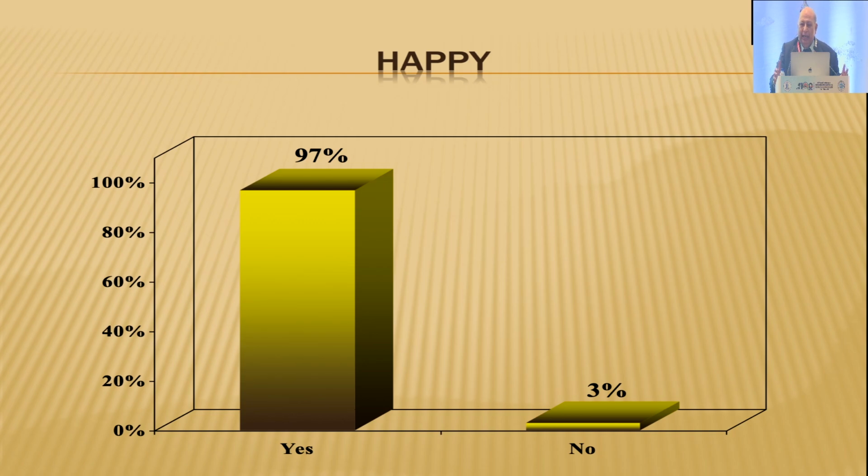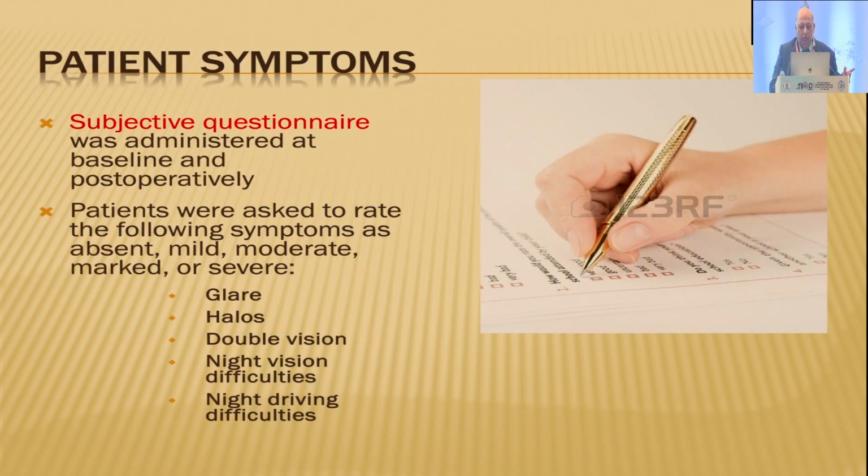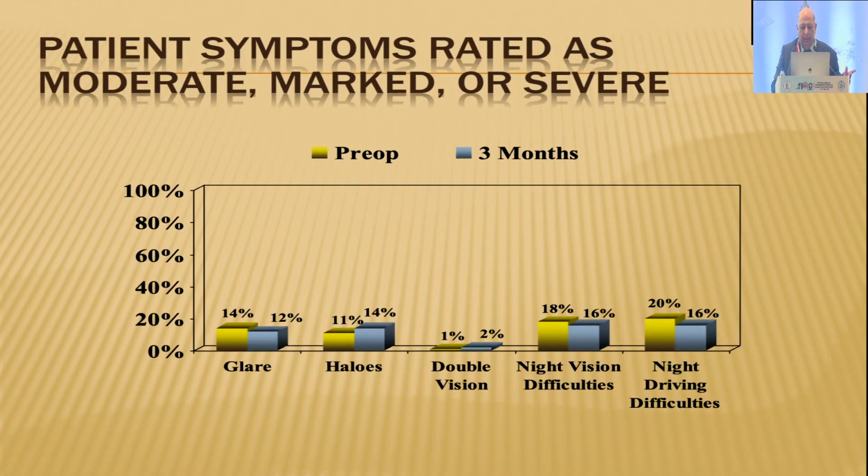You have to tell them glare only occurs with major lights. It doesn't occur with street lights. It doesn't occur with a single point source of light if the light is focal or above. It doesn't occur in your clinic, for example. And, at least for ophthalmic surgeons, you tell them it doesn't interfere with indirect ophthalmoscopy. These are things which you need to tell your patients. And if you assess your symptoms accurately, the glare, the halos, there's nothing much. Double vision is only occasional.